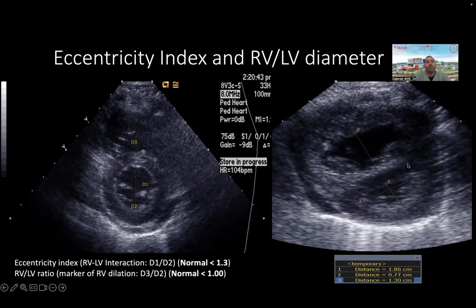So here you have septal flattening. That's an example. You can see this LV is actually a bit squished by this right ventricle. So don't forget that they share a common septal wall, and they also share some muscle fibers. So that's why sometimes the LV will start failing. Also, if the RV is not able to pump enough into the pulmonary vasculature, the LV will see less preload, and the LV will be impacted by becoming less filled because there's less pulmonary blood flow. And on top of it, the RV being pressurized will compress through the septum.